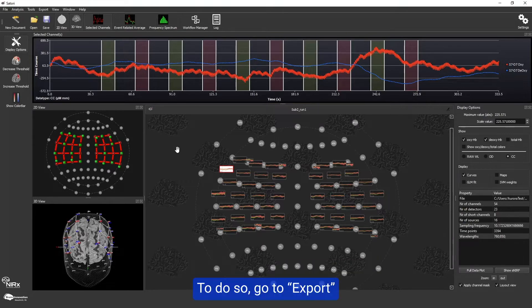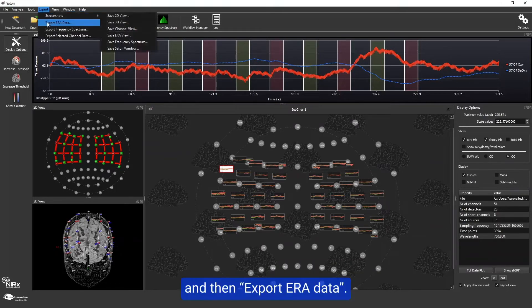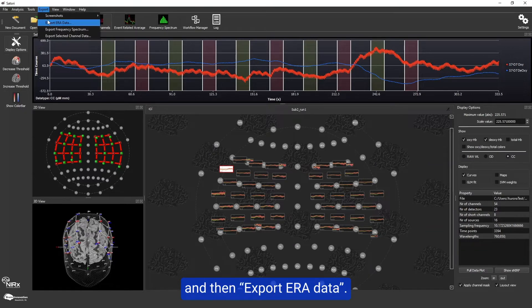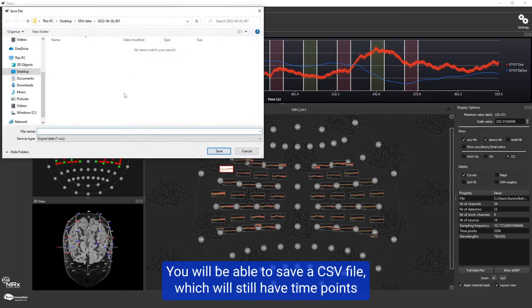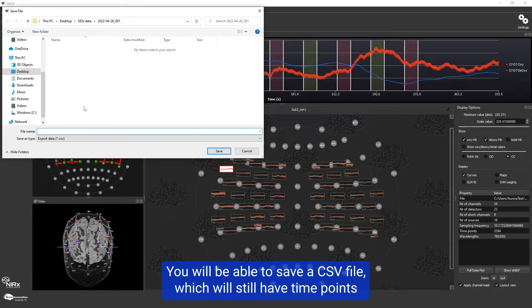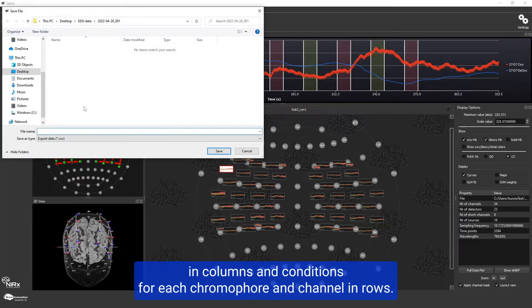To do so, go to export and then export ERA data. You will be able to save a CSV file which will have time points in columns and conditions for each chromophore and channel in rows.